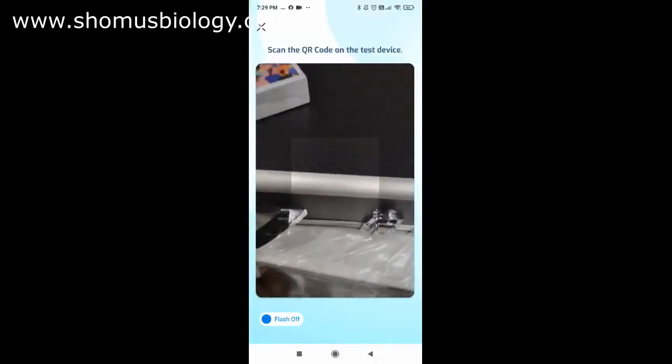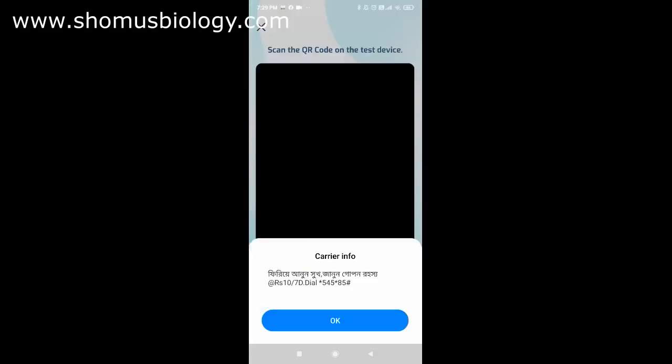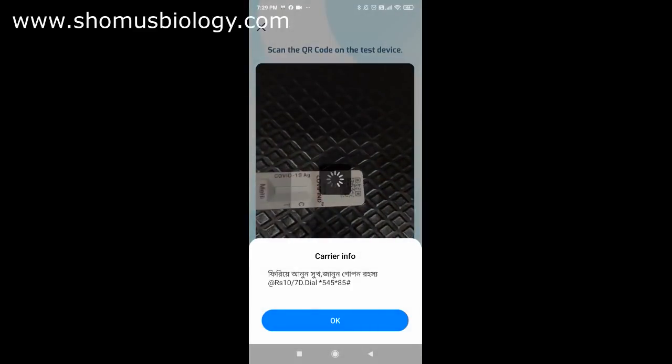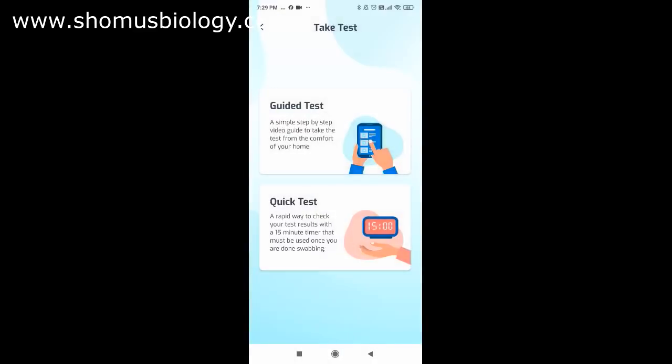Next, scan the QR code on the test device — done. The app offers two test modes: a guided test with a step-by-step video guide showing how to perform the test, and a quick test, which is a rapid way to check your result within a 15-minute timer that must be used once you are done swabbing.